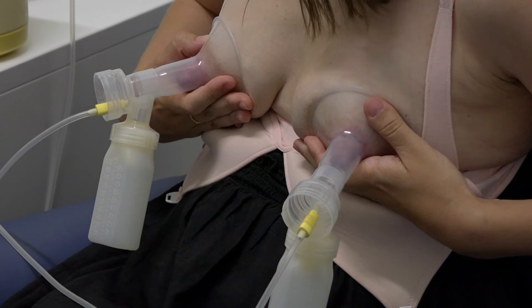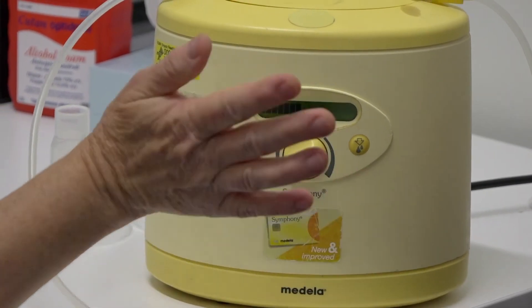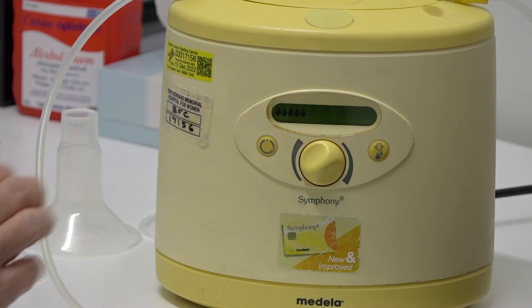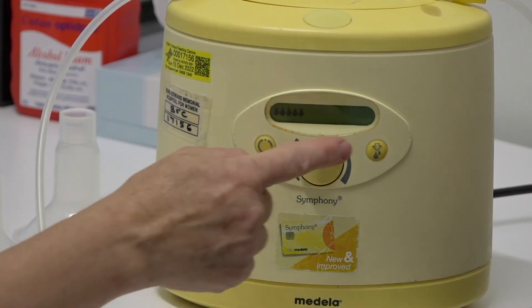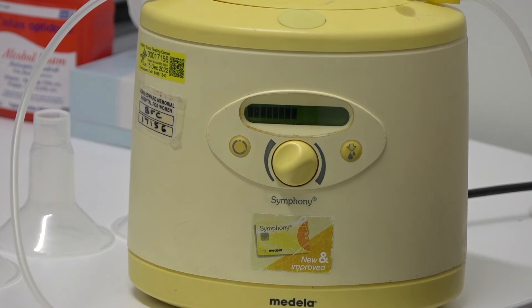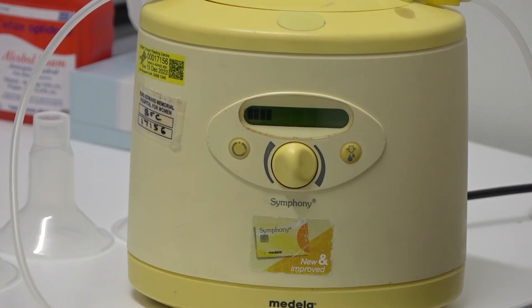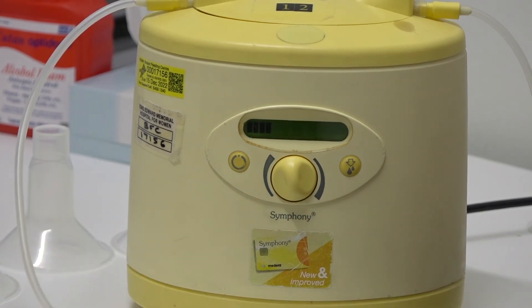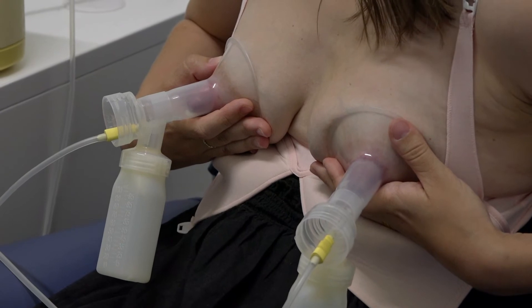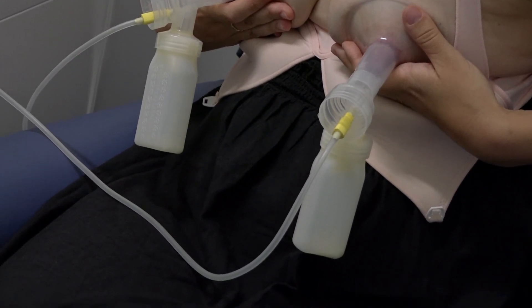We don't really need to stay on stimulatory any longer. This pump can sometimes jump up in pressure as part of the program — it's just done that itself. But if you were still on stimulatory with a letdown and ready to switch over, this is the bypass button you would use. Can you hear the difference in the sucking action? It's a bit longer and stronger. It jumped up a little there — we don't want it too sore. Does that feel comfortable? And we're getting free movement of your nipple into the shield, which is fantastic, and a nice flow of milk — while it's flowing well, just leave it on that extraction action.